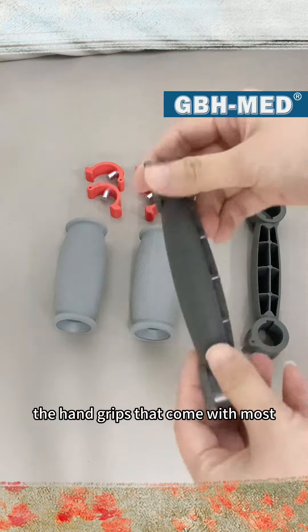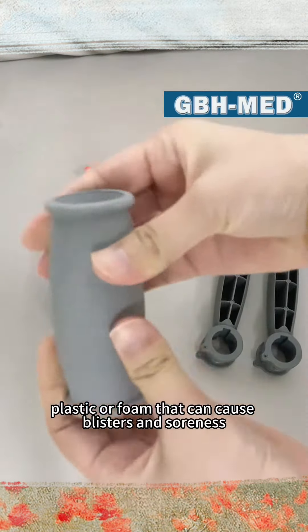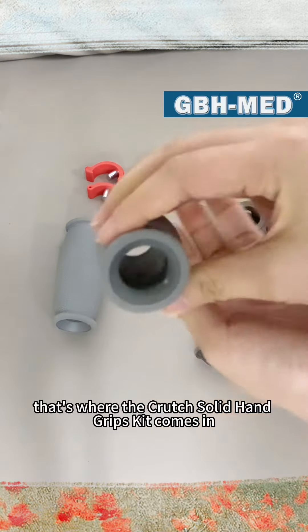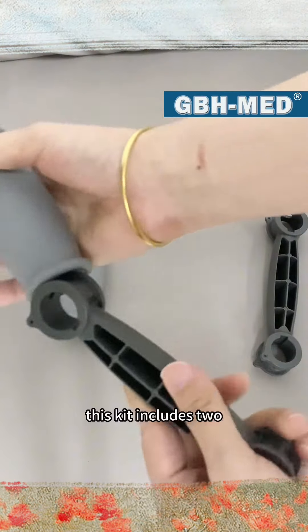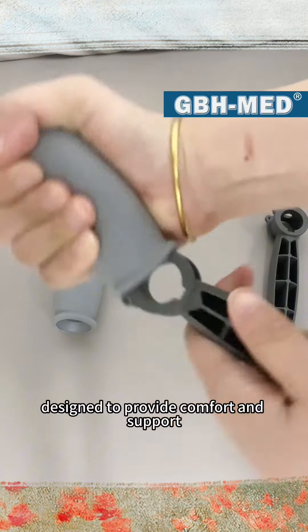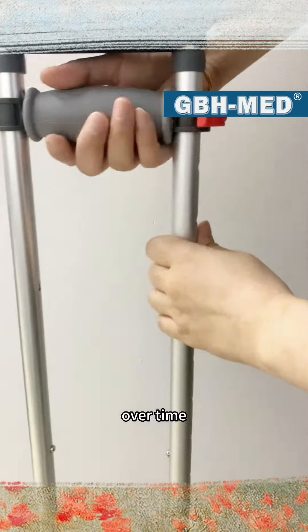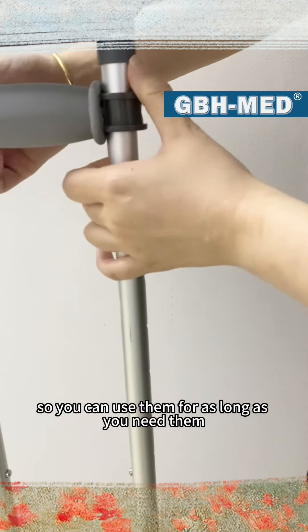The hand grips that come with most crutches are often made of hard plastic or foam that can cause blisters and soreness. That's where the Crutch Solid Hand Grips Kit comes in. This kit includes two soft and durable hand grips that are designed to provide comfort and support. They're made from a high-quality material that won't break down over time, so you can use them for as long as you need them.